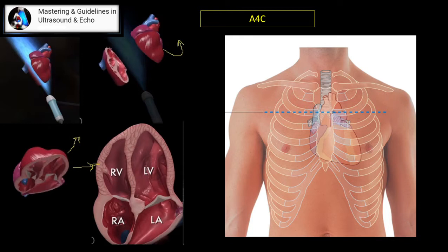But as you remember, I talked in the parasternal window about how the location of the heart depends on body habitus and position of the patient. For example, in people with a very big belly and overweight, usually the heart will be more horizontal and pushed a little more lateral and a little higher.